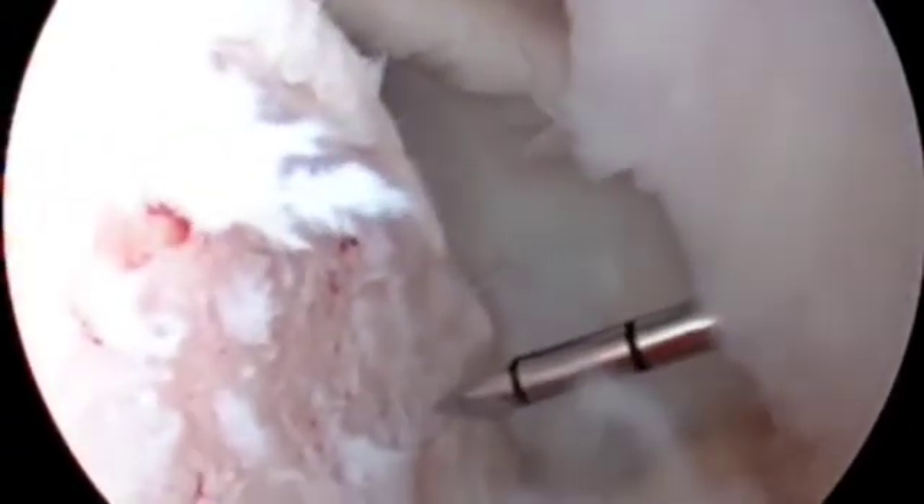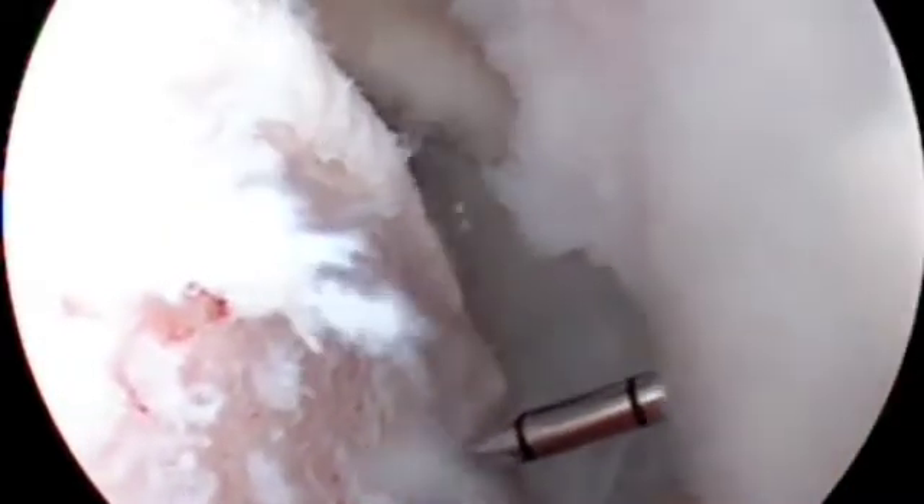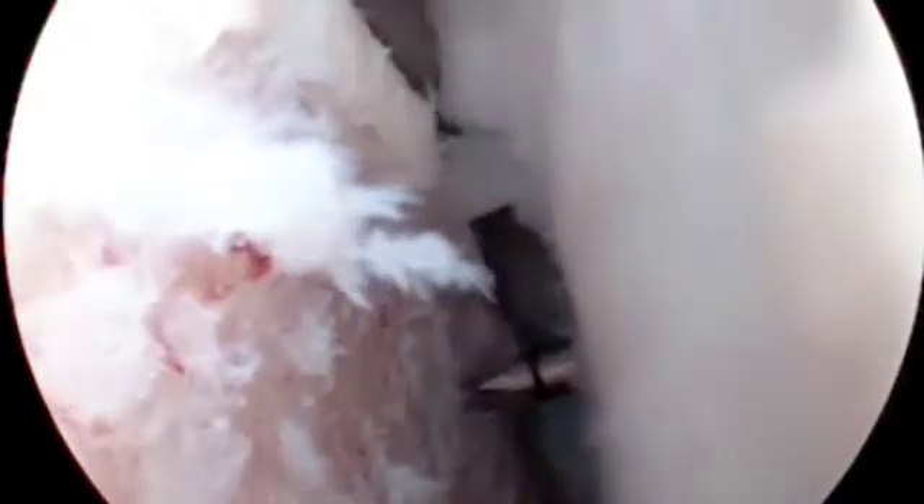The 4 mm cannula and obturator assembly are placed over the guide wire. Next, removing the guide wire and obturator, the surgeon leaves only the 4 mm cannula through the infraspinatus tendon and posterior joint capsule.